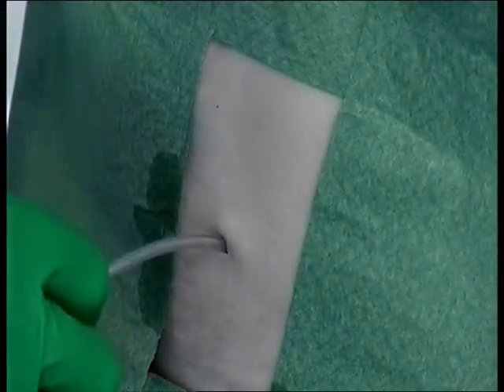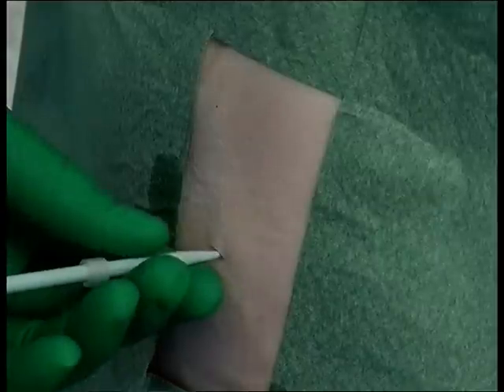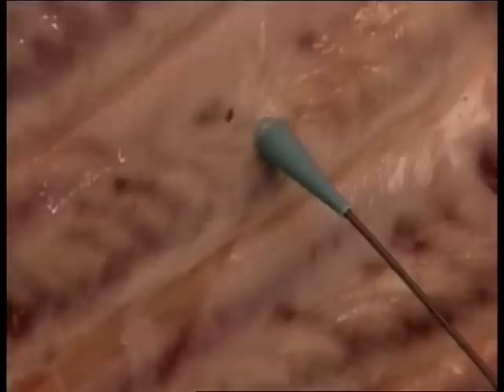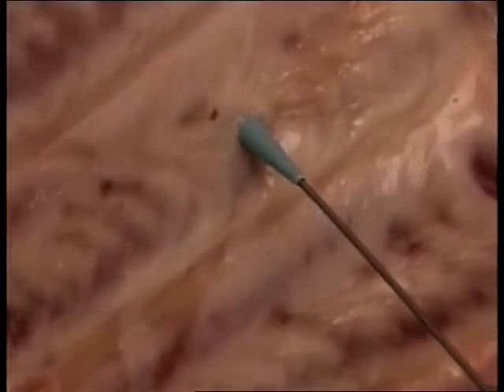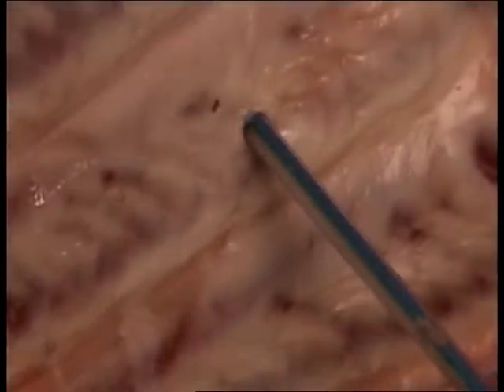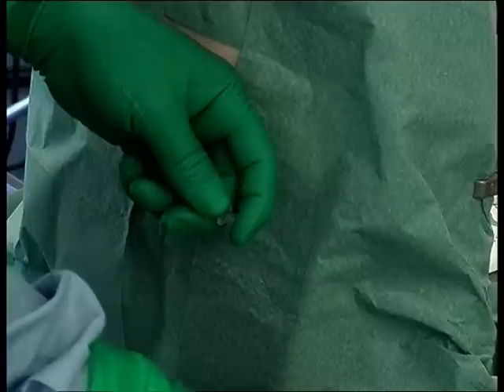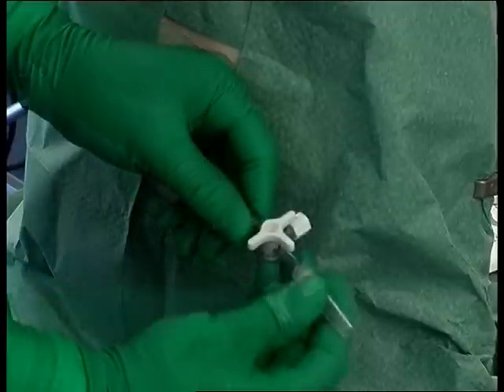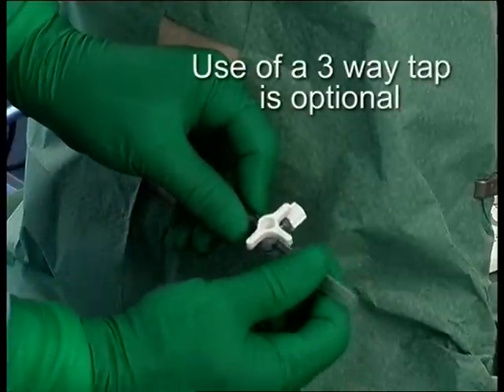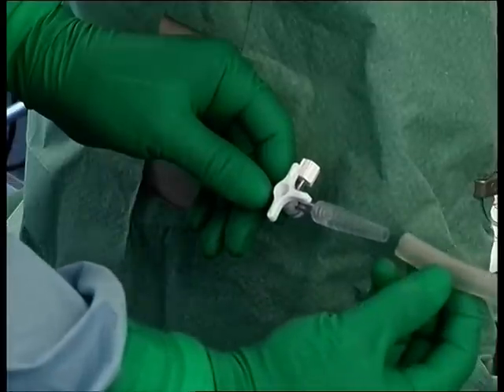With a rotating action, carefully insert the catheter into the pleural cavity. If resistance is met, remove the catheter and redilate the track. The pleural drain can now be connected via a 3-way tap and fir tree connector to a drainage system such as the Rocket Blue bottle or the Rocket ambulatory drainage bag.